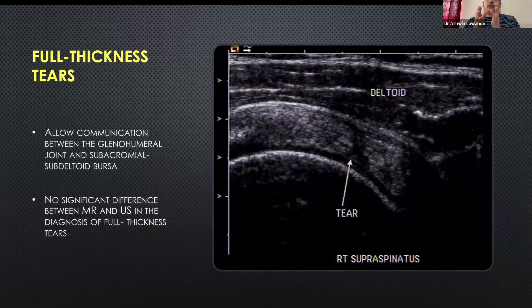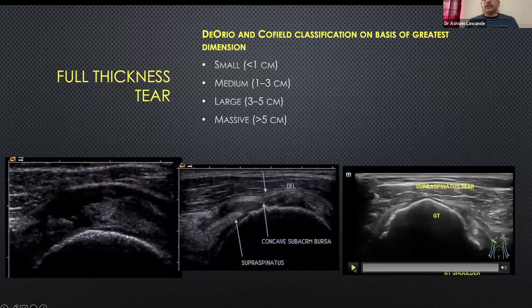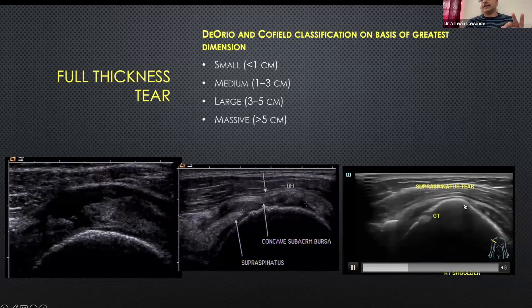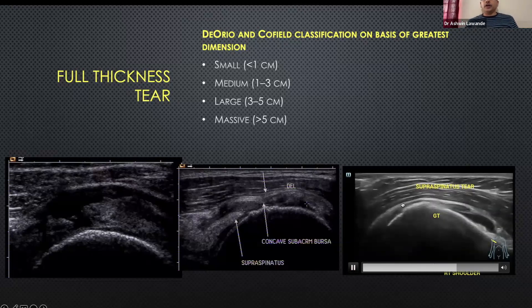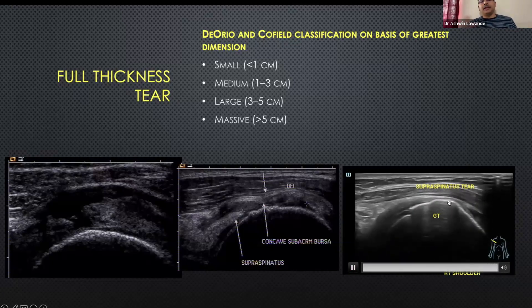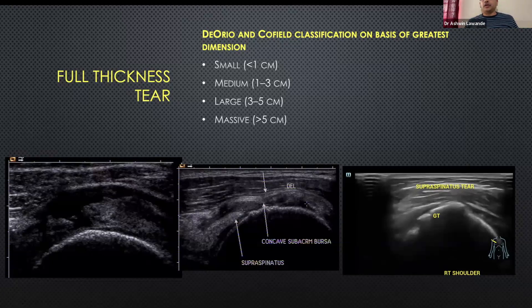A full thickness tear can involve only a small portion of the tendon, half the width, or the full width — and when the full width is involved, you get significant retraction. Smaller ones are less than one centimeter, medium ones are one to three centimeters. When more than one tendon is involved, you have a massive tear: you don't see any supraspinatus or infraspinatus at the tuberosity — just the deltoid lying over the naked tuberosity, with significant chronic retraction and muscle atrophy.